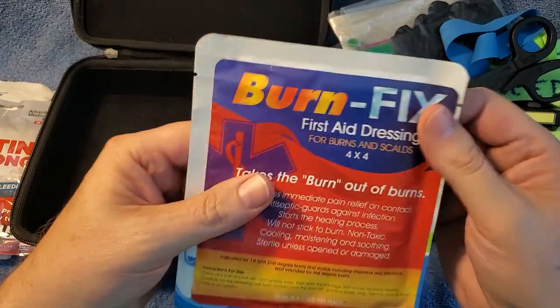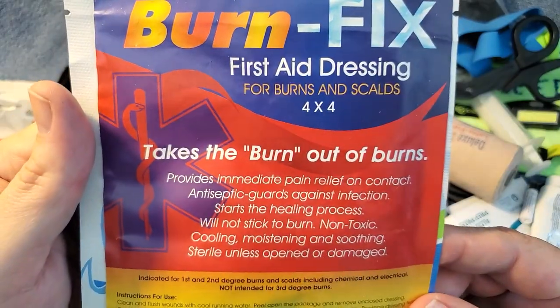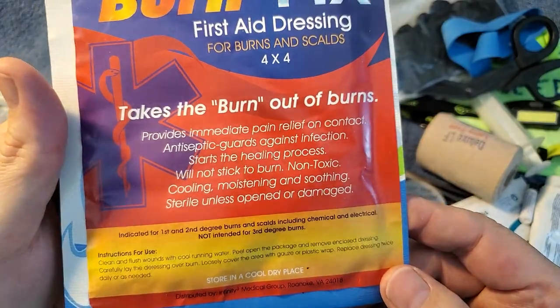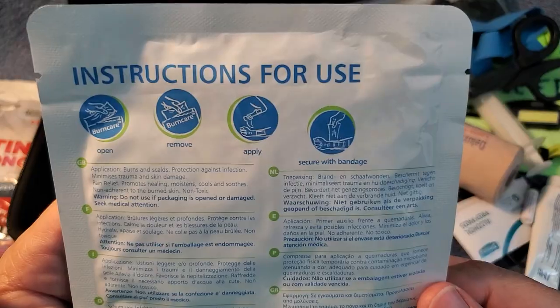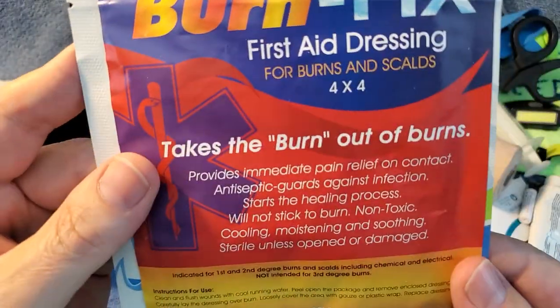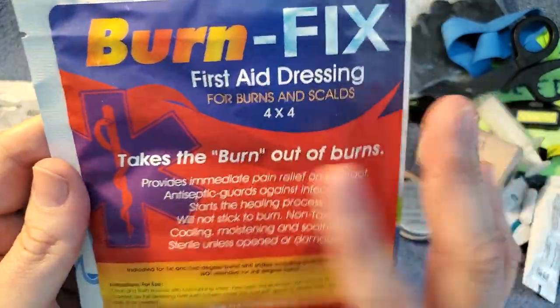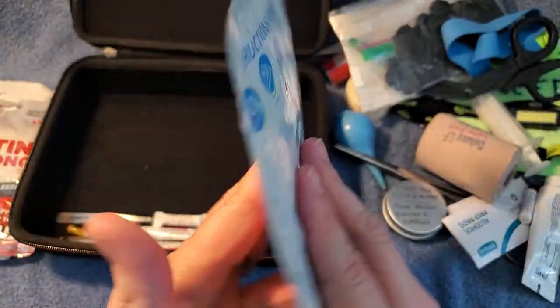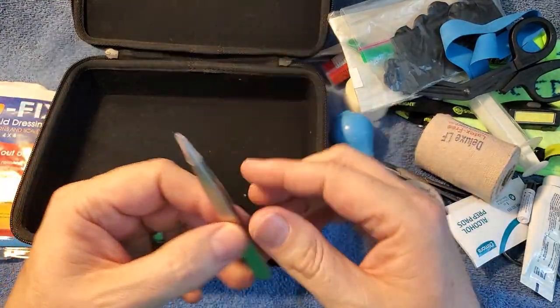I've got Burn Fix first aid dressing. It takes the burn sensation out — it's really for pain relief. It doesn't actually do much to help the healing process, because unfortunately they don't really make anything that helps burns heal. But it's sterilized, so you don't have to worry about causing an infection. Remember, this is just for first and second degree burns — you would never slap this on a third degree burn because there's really nothing you can do for a third degree burn in the field.